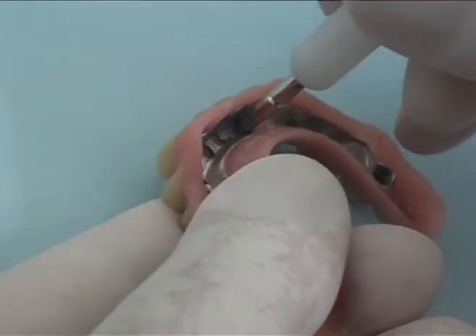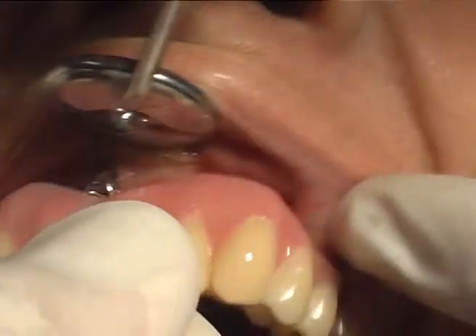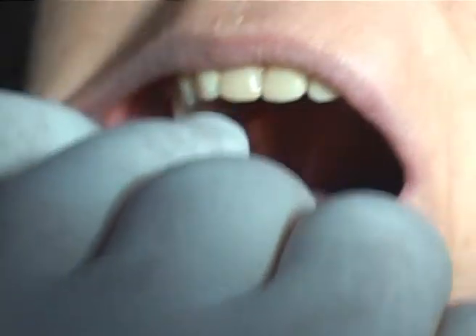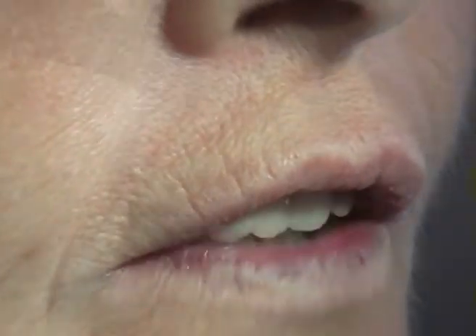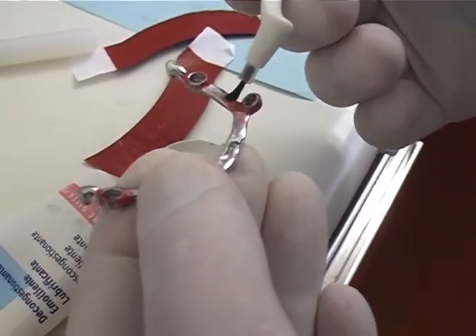Insert only 2 or 3 elastic retention caps into the removable denture. Replace the bar and screw it tightly in place. Insert the denture and check the articulation. Detect bad connections and eventually eliminate them. Check while masticating. Thanks to the few elastic retentive caps, the overstructure can be inserted and removed without any problem, even though the bar is not cemented yet.